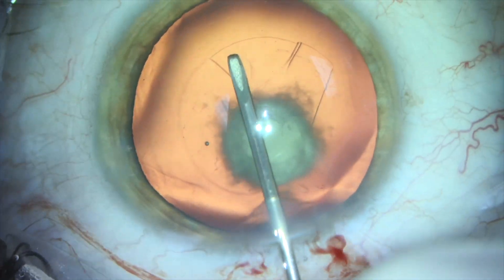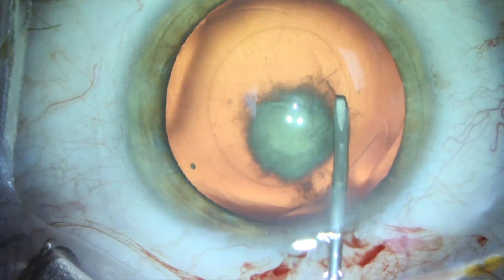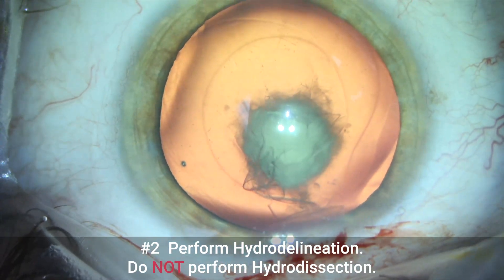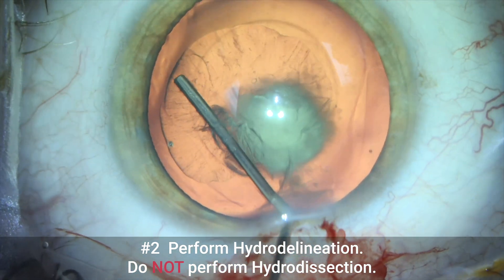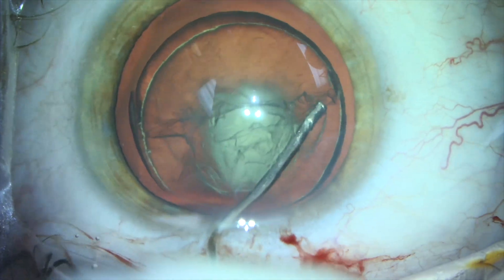Number two, we need to perform hydro delineation instead of hydro dissection. Hydro delineation, where we get this nice golden ring, creates a fluid plane between the nucleus and epinucleus. We want to avoid any sudden force between the cortex and posterior capsule.